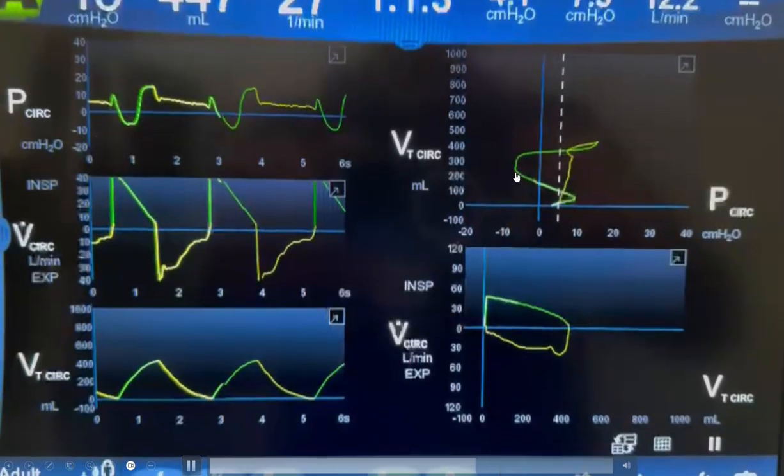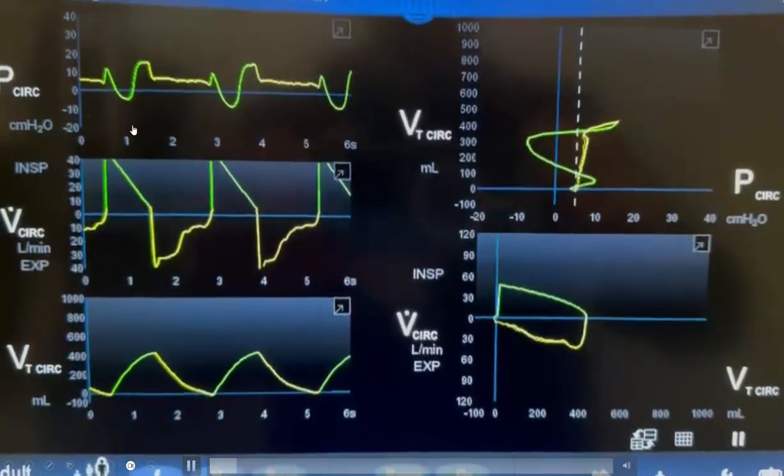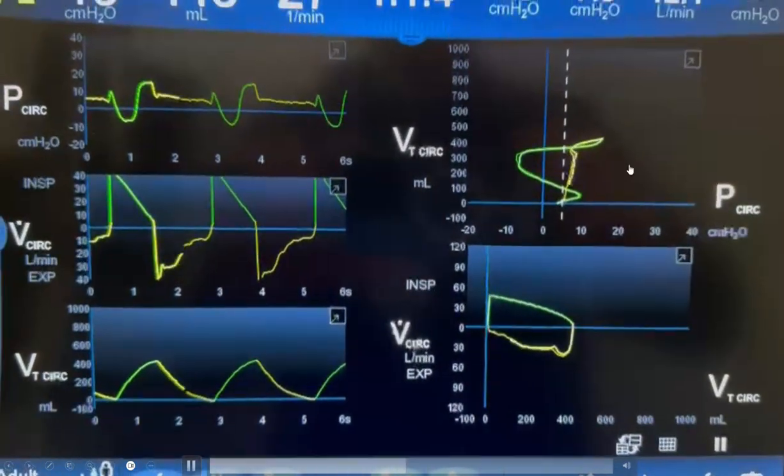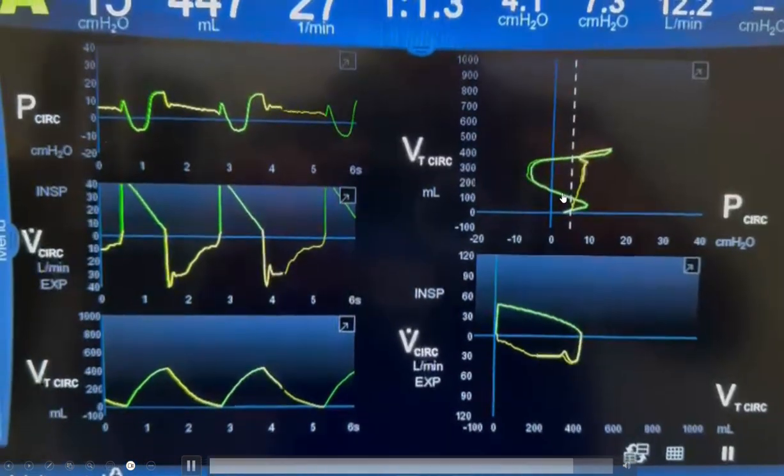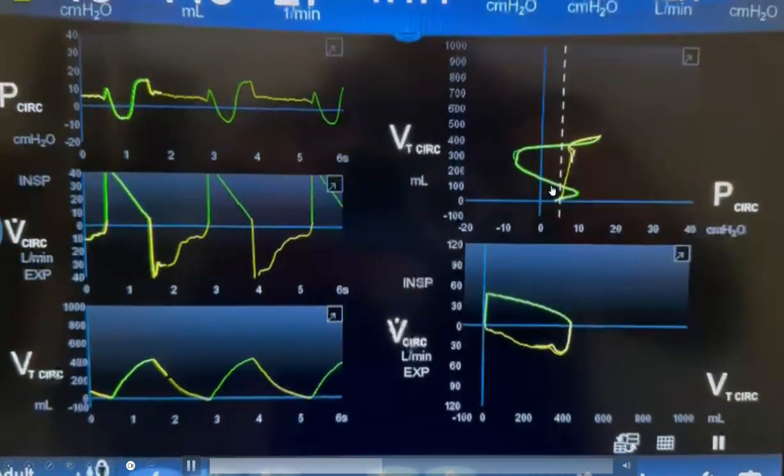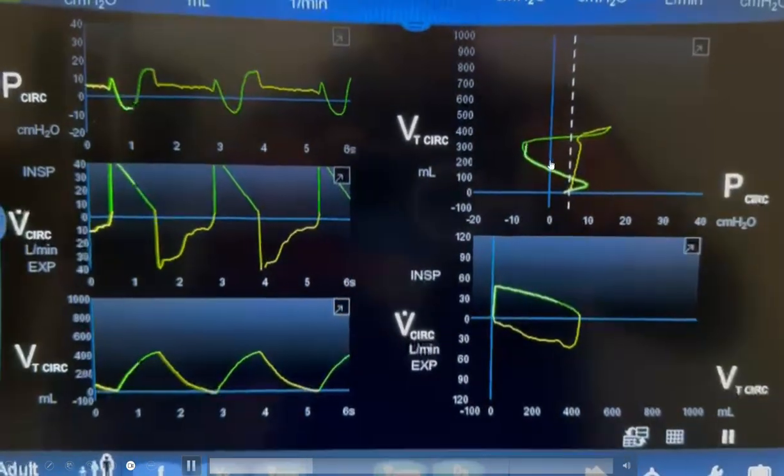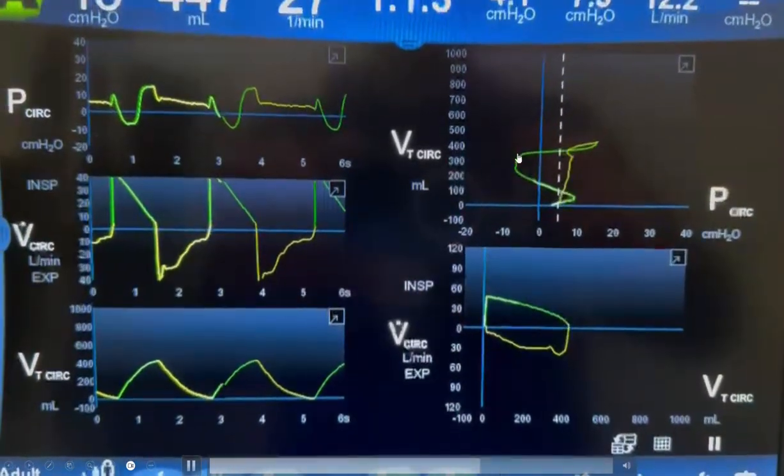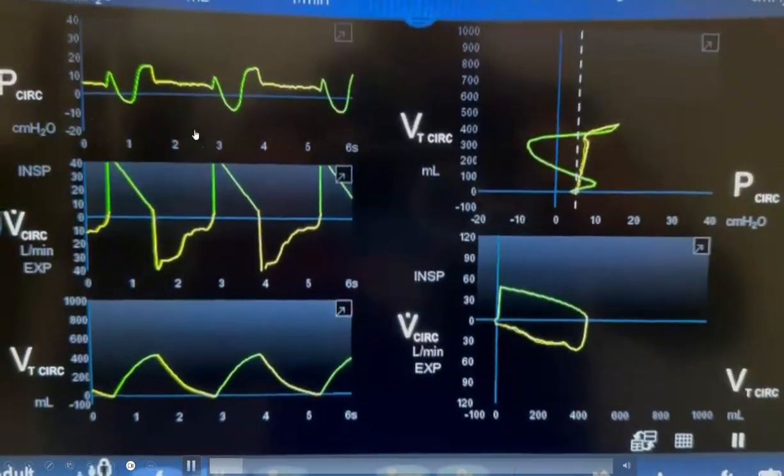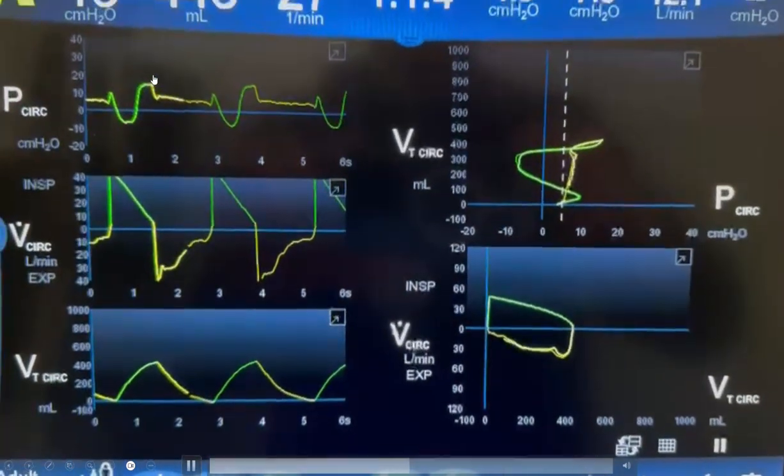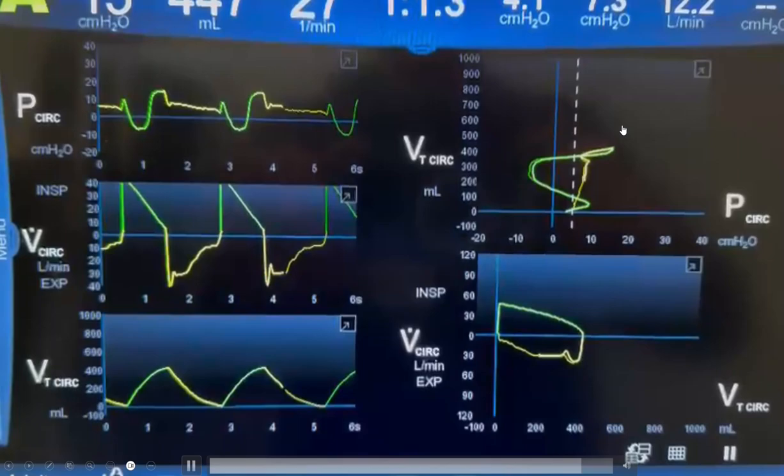This area here correlates with this drop in the pressure. Along with this drop in the pressure, you can see the volume is increased—it goes on the y-axis. The volume is increased, and then at this point the pressure starts to go up again.